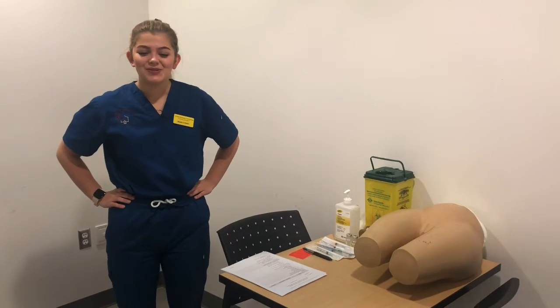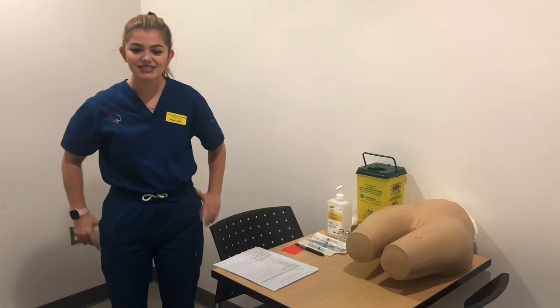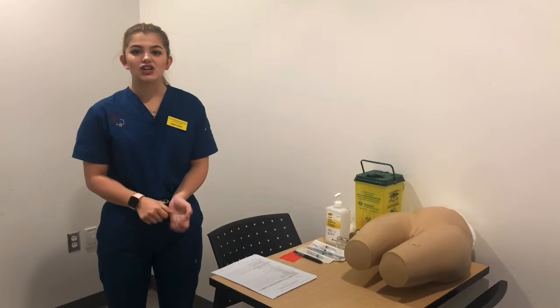Okay, so I'm going to go over how to prepare and administer subcutaneous and intramuscular injections. I will be injecting heparin subcutaneously and Haldol intramuscularly.